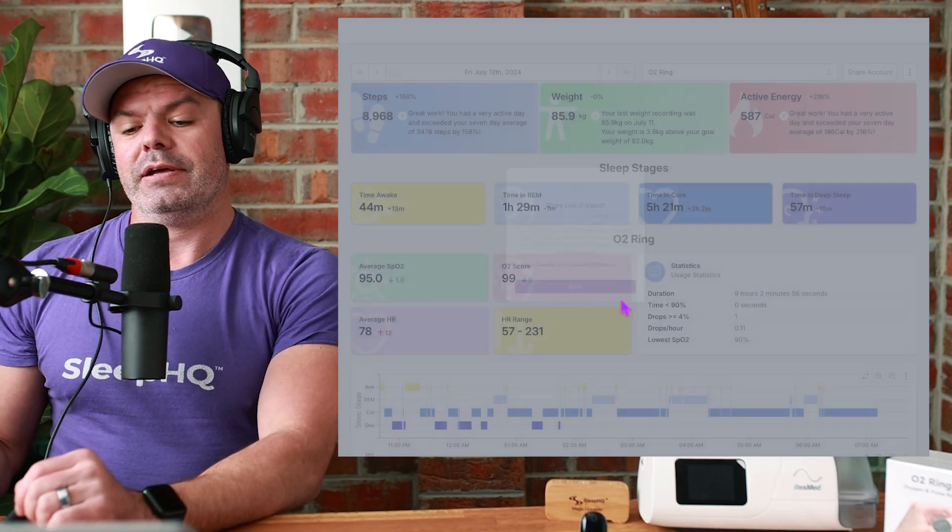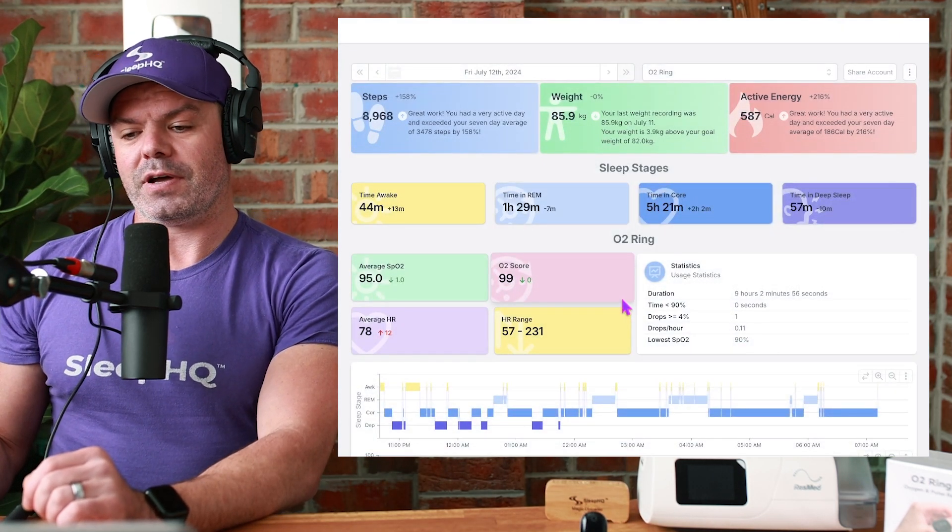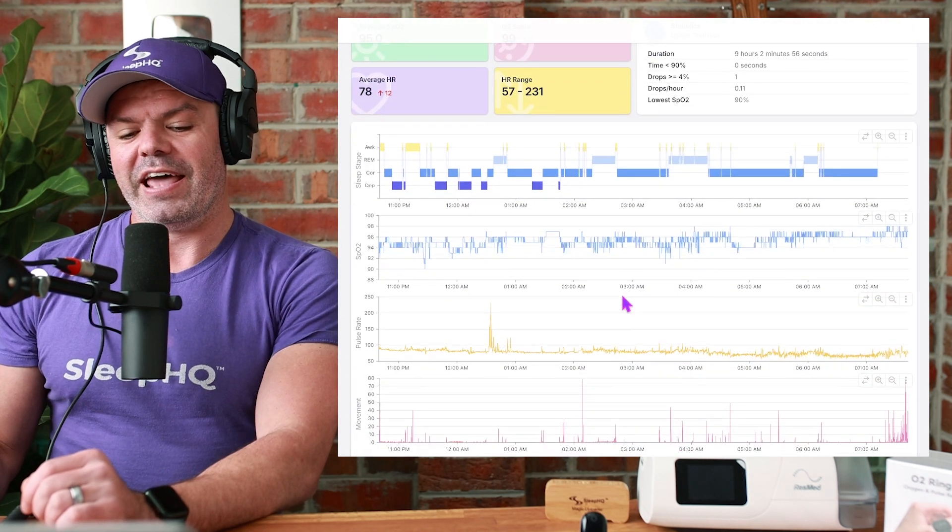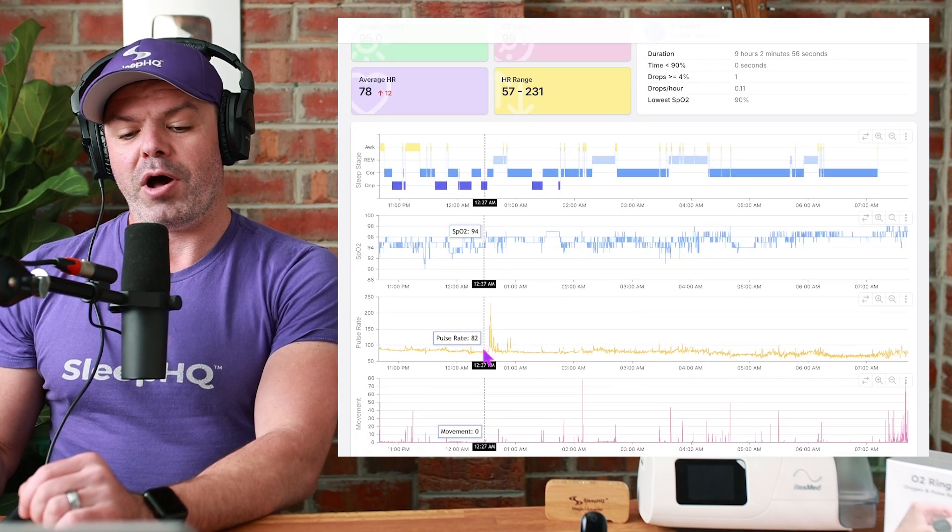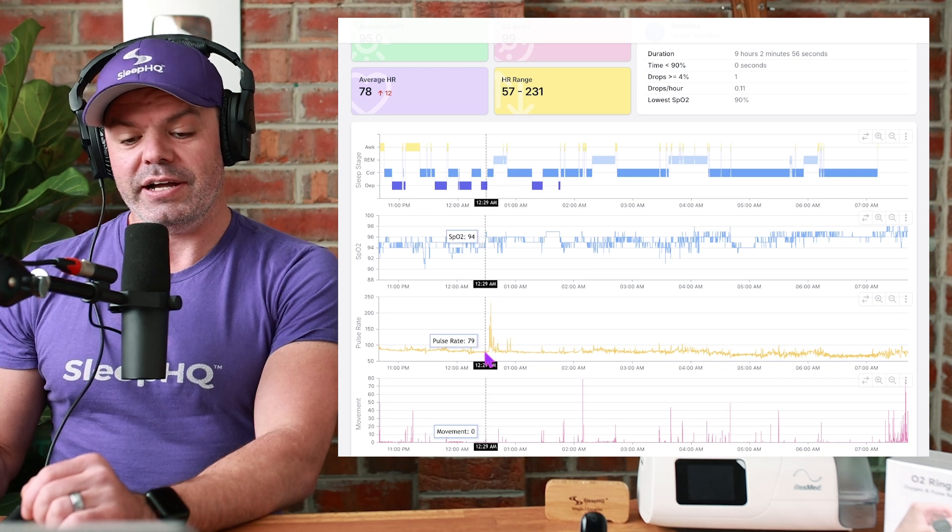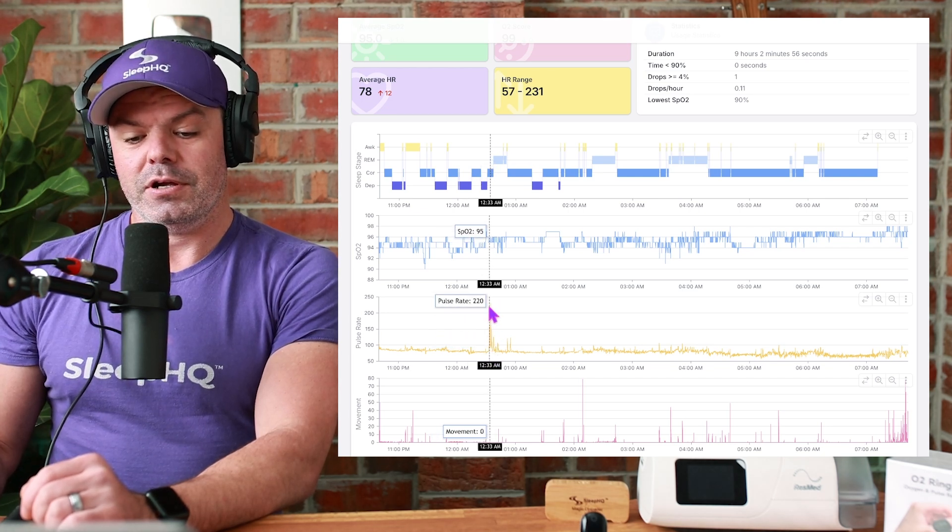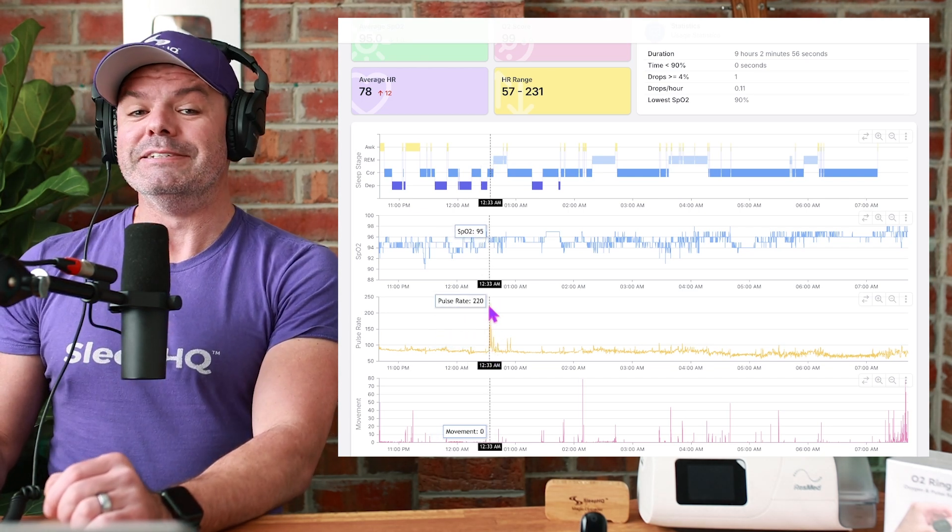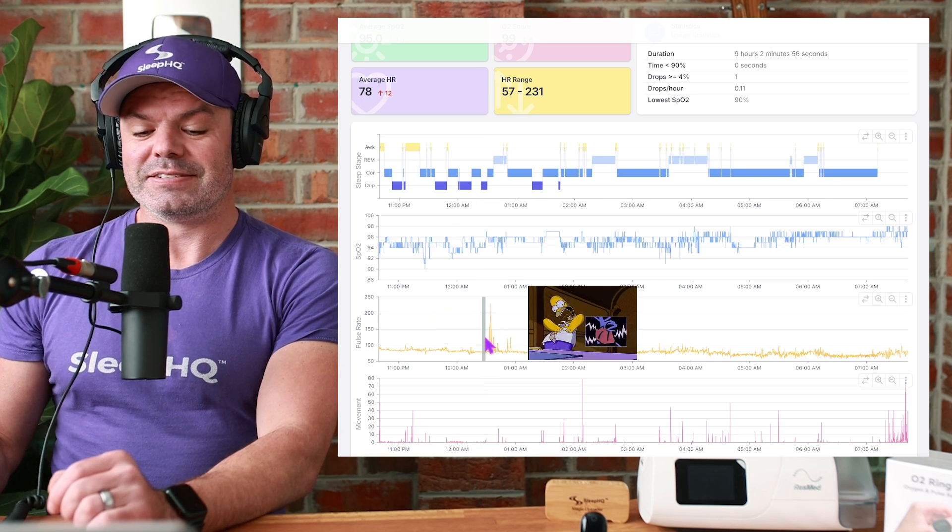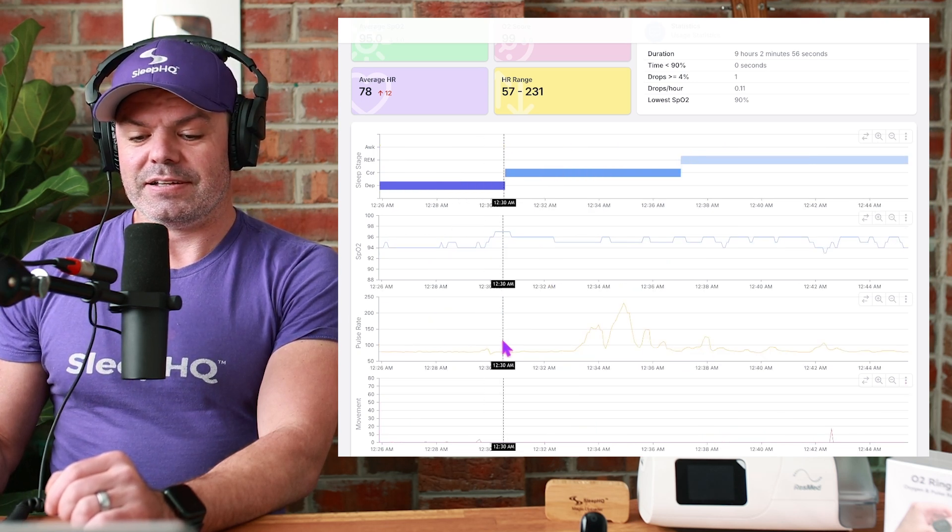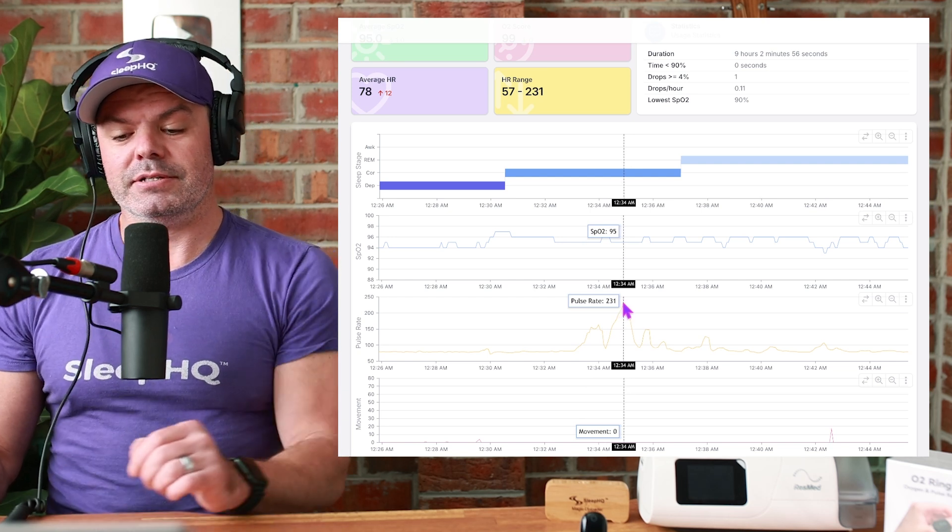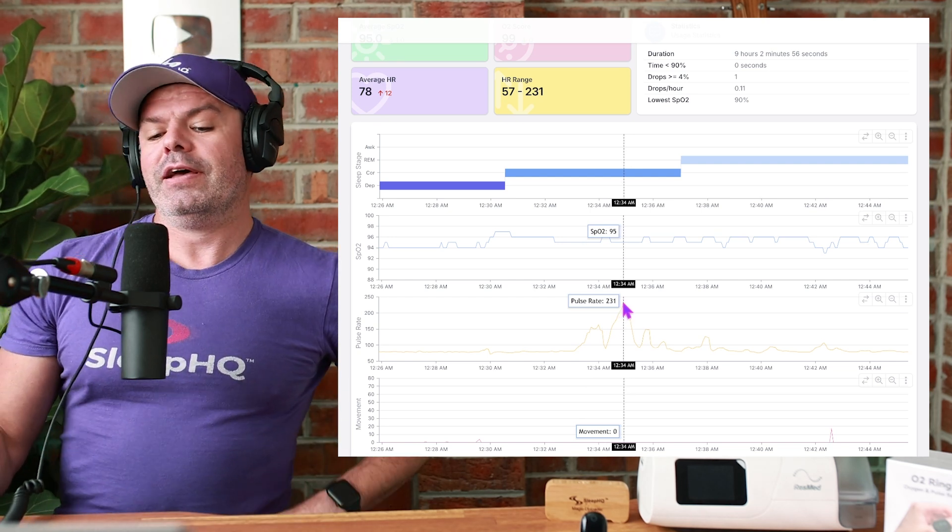Let's say I scrolled down here and I noticed that my pulse rate went from 79 up to 220. Let's zoom in and check that out. Wow. Man, Everest right there. 231. Must have been a bloody good dream.